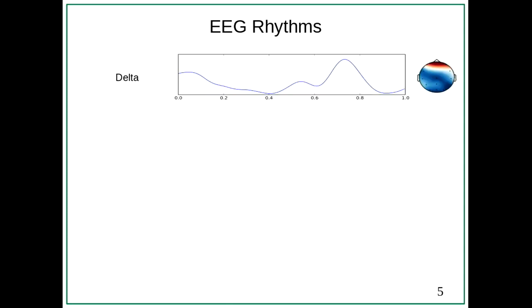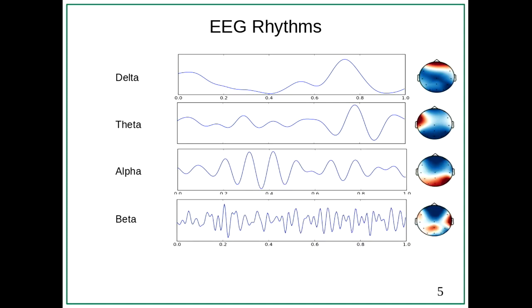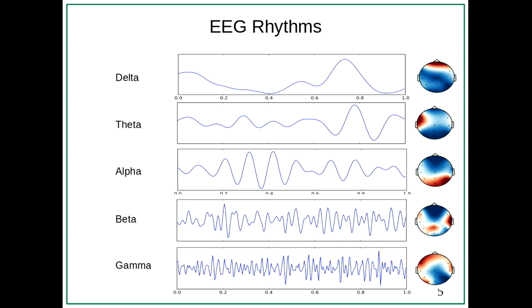So then some words on how these signals are analyzed. An often used method is frequency analysis. So basically you look at all kinds of different types of waves. You have slower waves, you have slightly faster waves, you have even faster waves still. The scale here is 1 second. This one is like 10 oscillations per second, and this is the rhythm that's most prominently present in EEG signal if you close your eyes, in most people, not everybody.